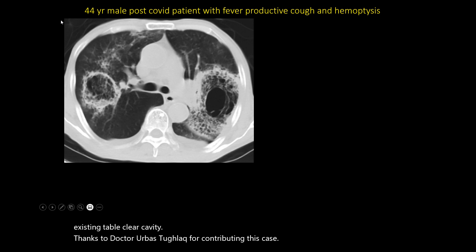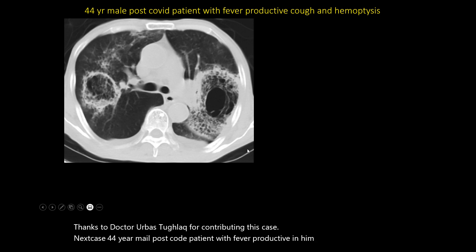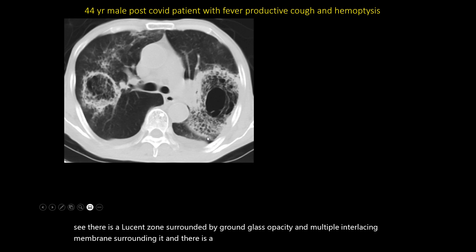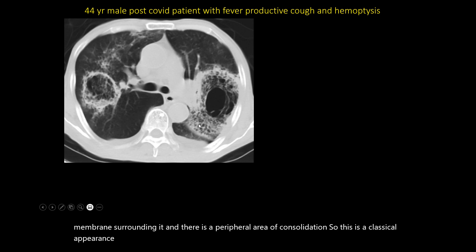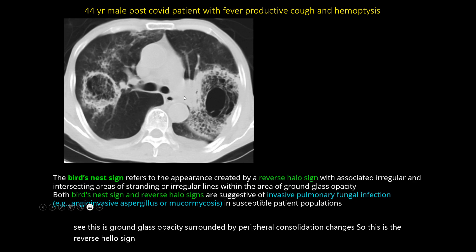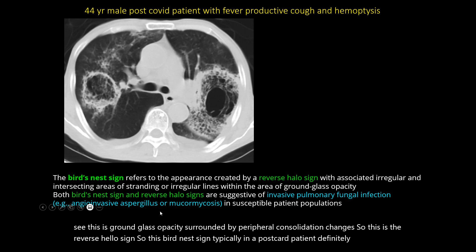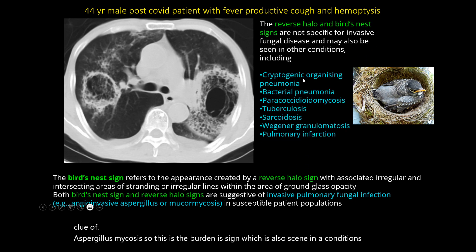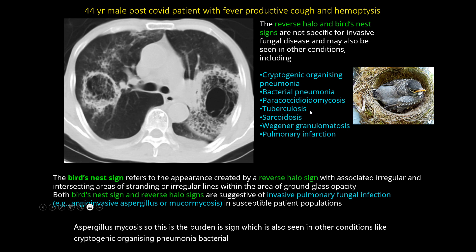Next case: A 44-year-old male, post-COVID patient, with fever, productive cough, and hemoptysis. There is a lucent zone surrounded by ground-glass opacities with multiple interlacing membranes and a peripheral area of consolidation — this is the classical bird nest appearance or bird nest sign. There is also ground-glass opacity surrounded by peripheral consolidation, which is a reverse halo sign. In a post-COVID patient, the bird nest sign gives a clue for invasive aspergillosis or mucormycosis. This sign is also seen in cryptogenic organizing pneumonia, bacterial pneumonia, paracoccidioidomycosis, tuberculosis, sarcoidosis, granulomatosis with polyangiitis, and pulmonary infarction.